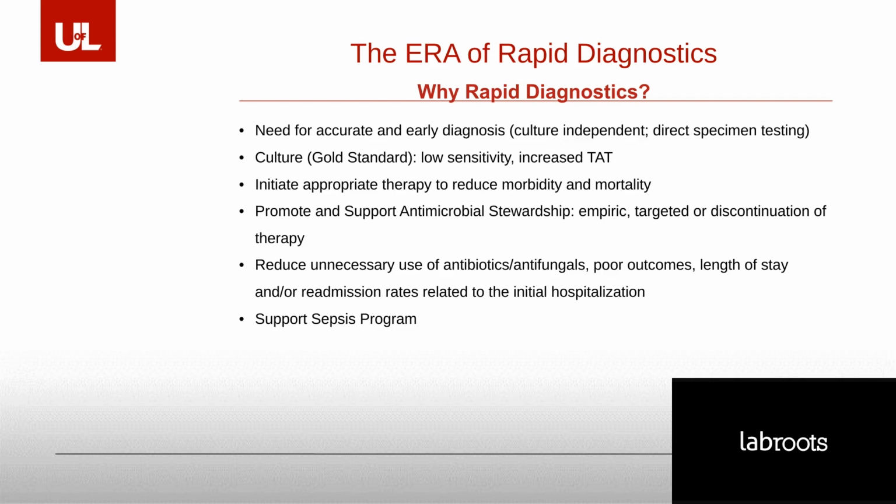As I said, very much a part of the antimicrobial stewardship program, usually with empiric therapy initiated, maybe stay on for 3 or 4 days. With rapid diagnostics such as T2, we've been able to demonstrate that they get more targeted therapy or even discontinue therapy. And all that adds up to money, of course, of which the administrators like to see.